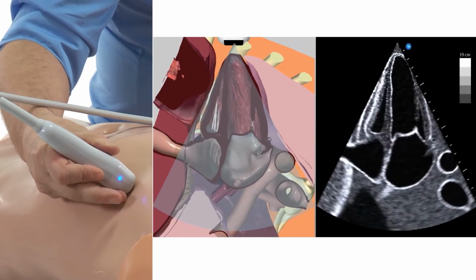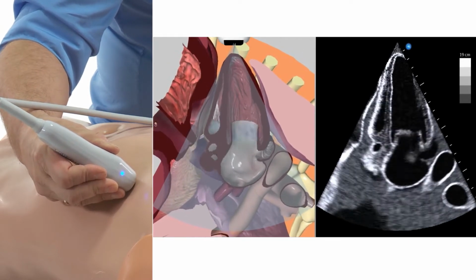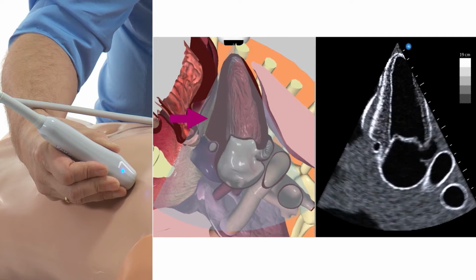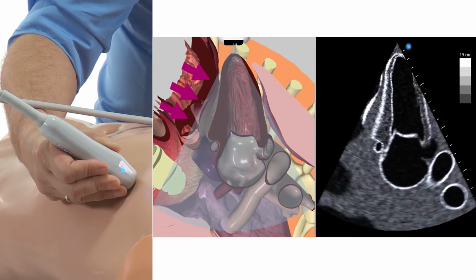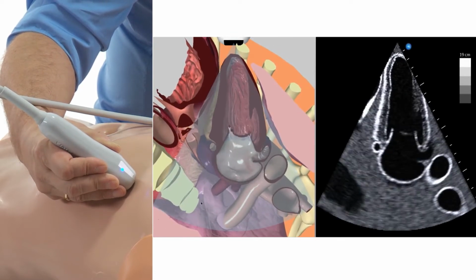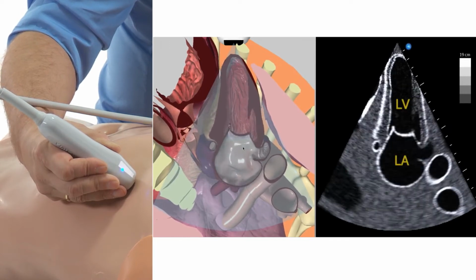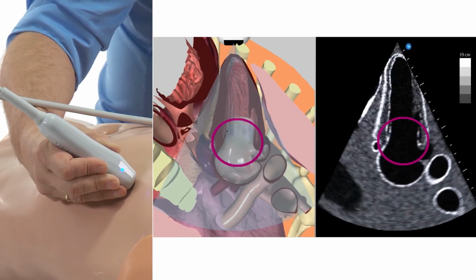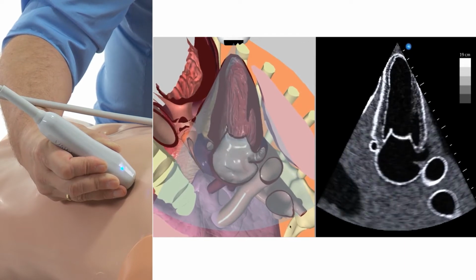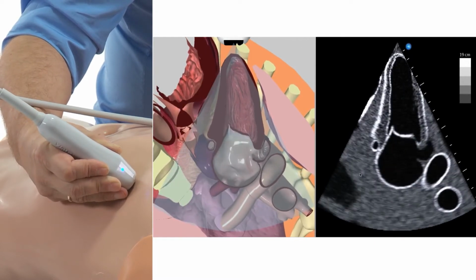You see that the right ventricle is slowly starting to vanish, and we are now looking at the anterior part of the body here and the posterior part here. You see that the diaphragm is coming into the field of view, and so now we have the 2-chamber view with only the left ventricle and the left atrium visible. We have the mitral valve, which cannot be distinguished into anterior-posterior leaflet, and we see here actually the descending aorta in kind of a long axis view if you play around a little bit.